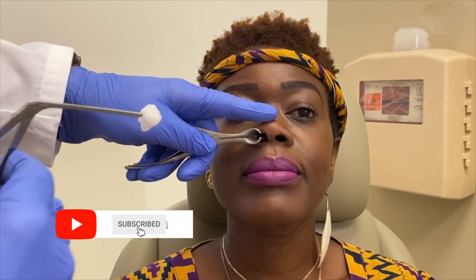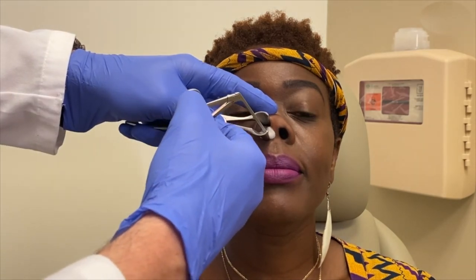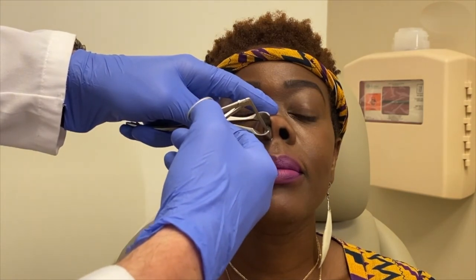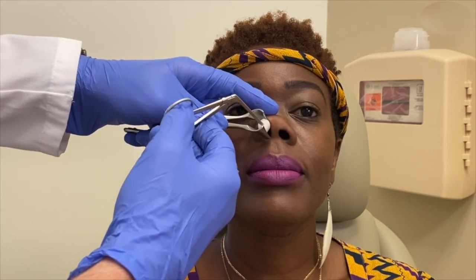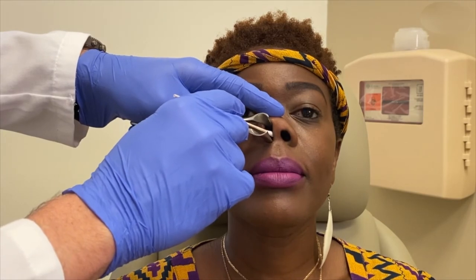With the patient positioned comfortably in the examination chair, place a cotton ball soaked in 4% lidocaine with or without oxymetazoline in the anterior nasal cavity. After approximately 10 minutes, remove the cotton ball and assess the level of anesthesia by touching the mucosa with an instrument or cotton-tipped applicator.